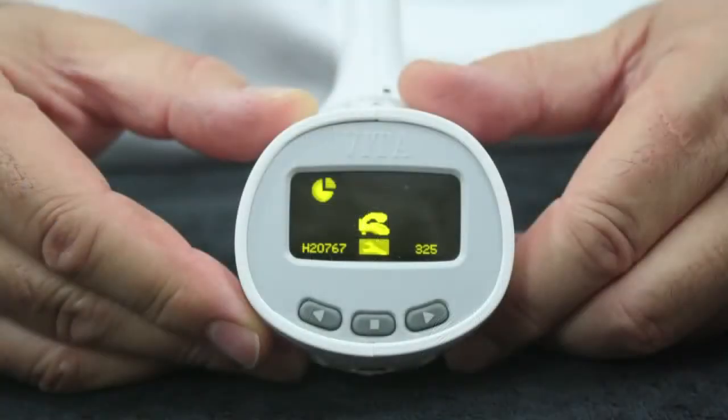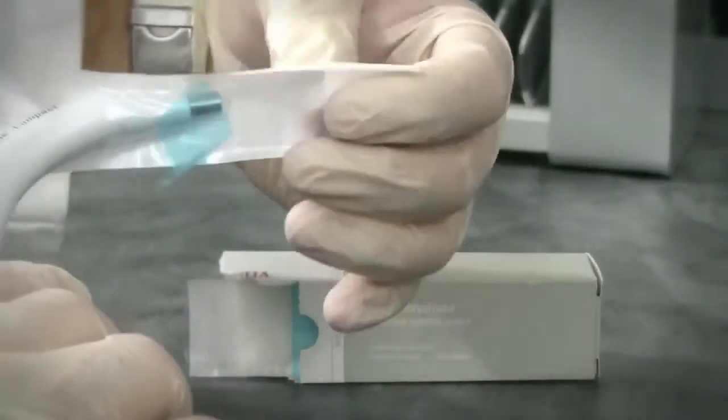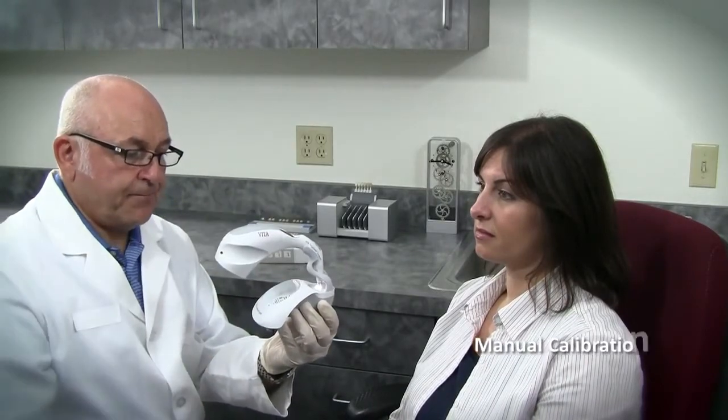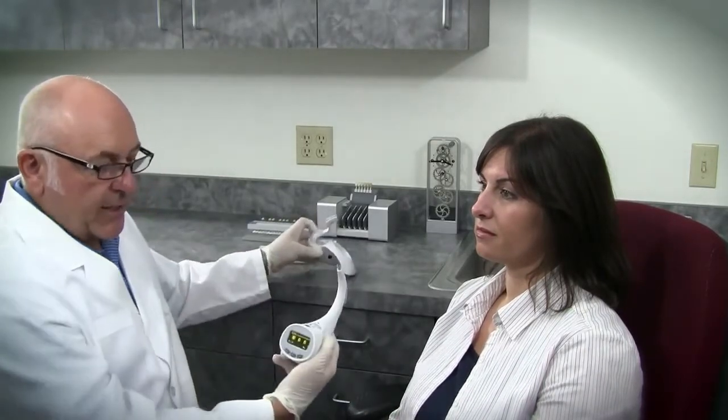I'm going to take the shade of my patient using the EasyShade Compact using the manual calibration technique, when it's not powered to an outlet. Take the unit out of the base and by depressing any of the buttons the unit starts. You can see a flashing icon telling me to calibrate. Before doing so, I'm going to apply a cross infection shield or barrier — the pocket for this is located below the blue disposable wrapper. I tear it off and pull the shield tight over the hook. Now I'm going to calibrate the unit by placing it in the holder. In the manual mode, I depress the button and wait for the second flash and the tone. We've now calibrated and are ready to take the patient's shade.